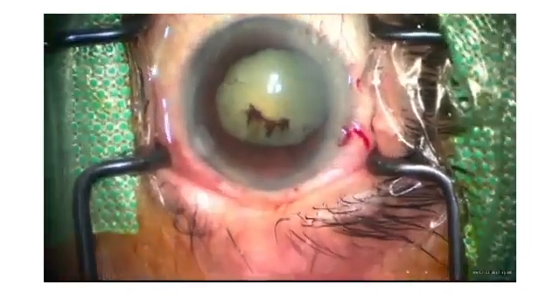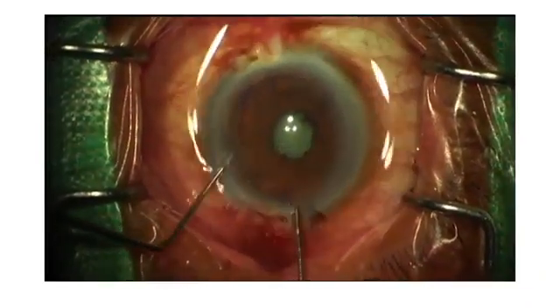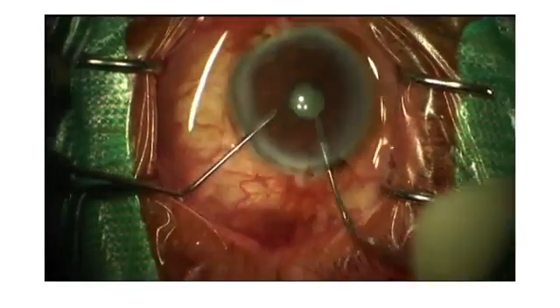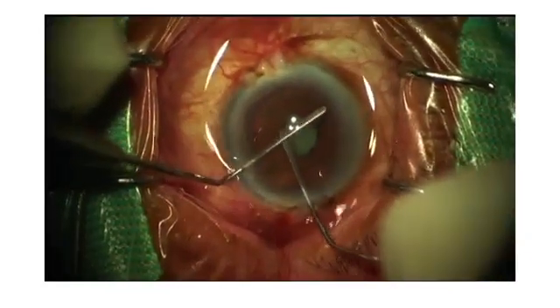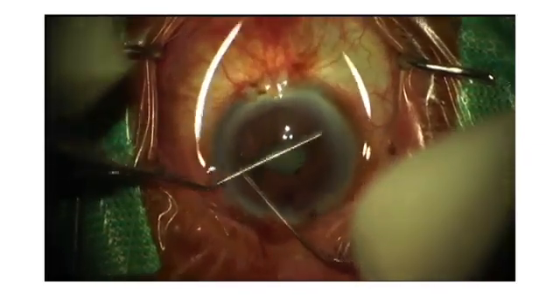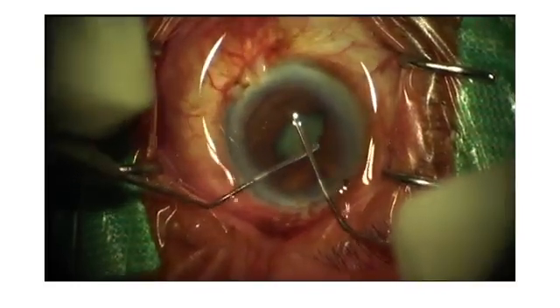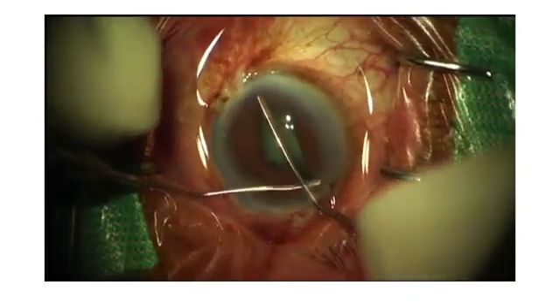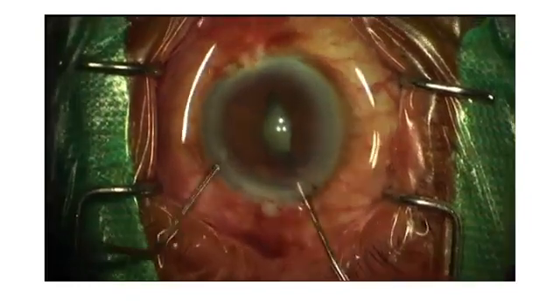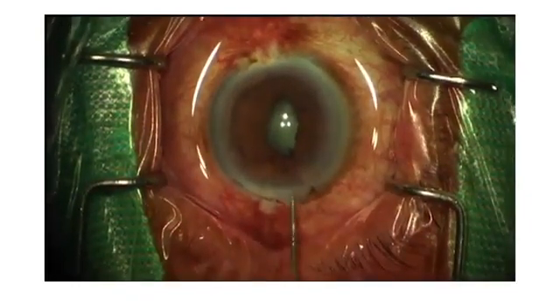Another way is you use instruments like a Lester lens manipulator, two instruments to stretch the pupil 90 degrees apart, and after this, probably you do the viscodilatation, put the viscoelastic into the anterior chamber, and sometimes that should be enough to open the pupil to perform the surgery, like this case that the video shows.